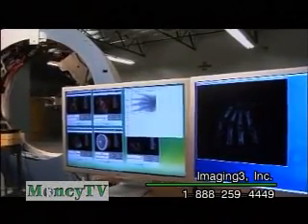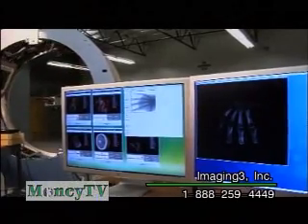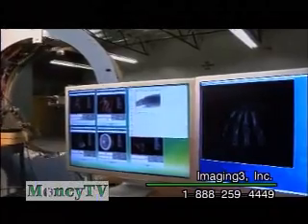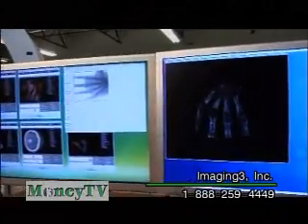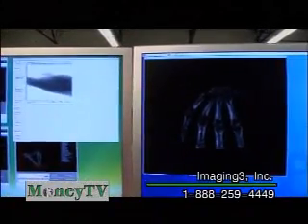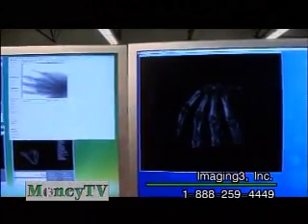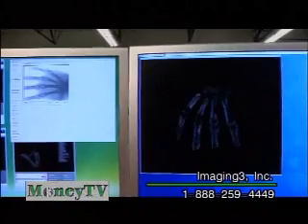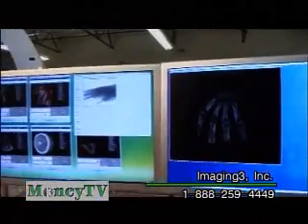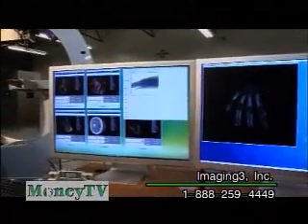continuing to update. As we've said in the past, we can do 3D real-time imaging. We're streaming the video through and getting a new 3D construct every second. It's being displayed here, and we'll pan over from one side or another. We wanted to make sure that we got the full prototype being displayed in one frame.